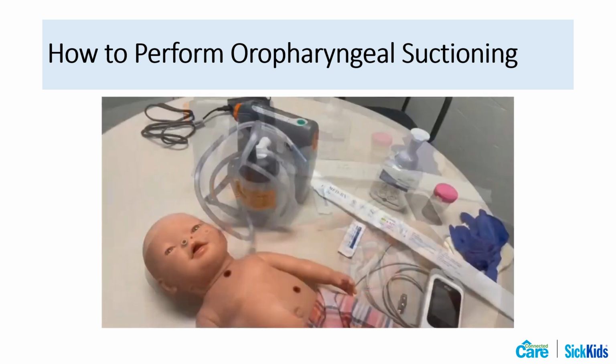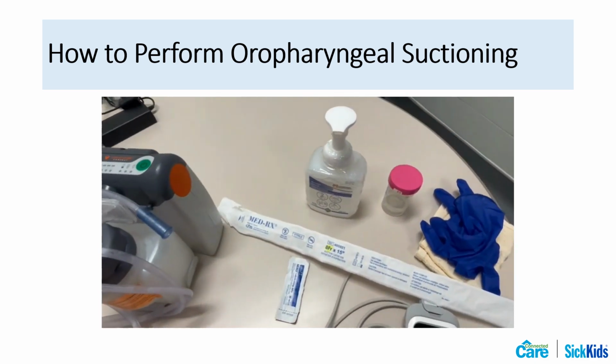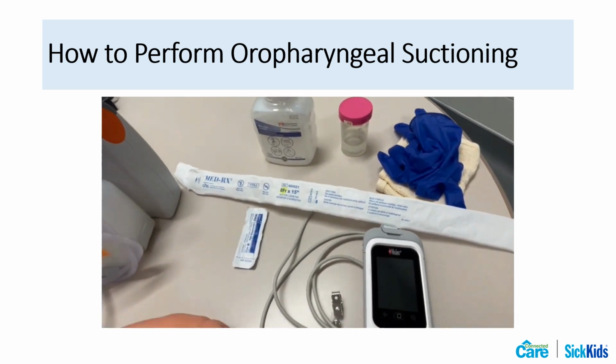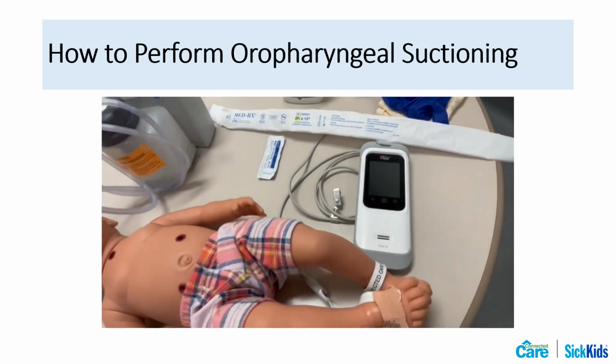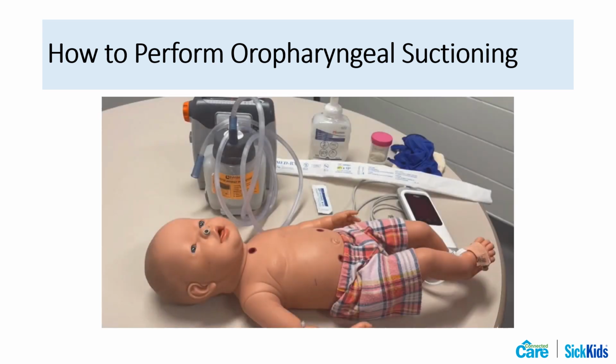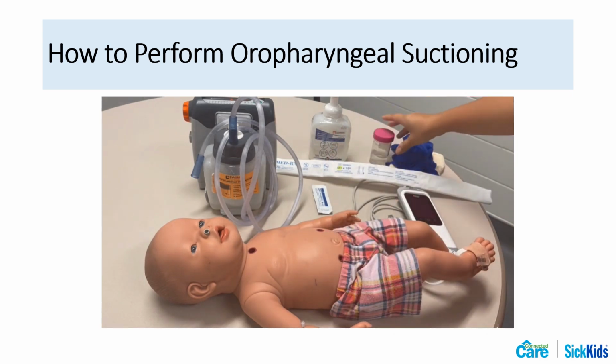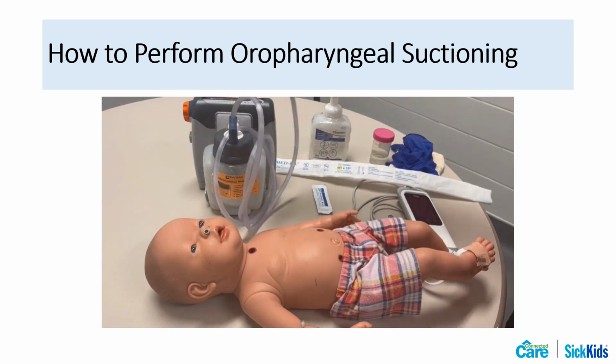This video will demonstrate oral pharyngeal suctioning. Gather your equipment and supplies and have them nearby. Fill a clean container with sterile water or saline. Ensure your suction machine is set to the appropriate pressure.